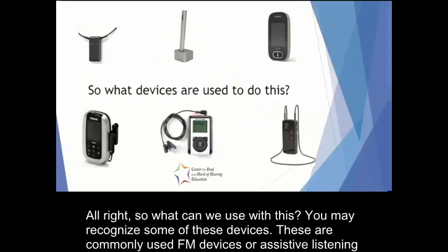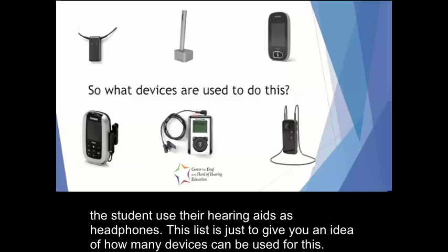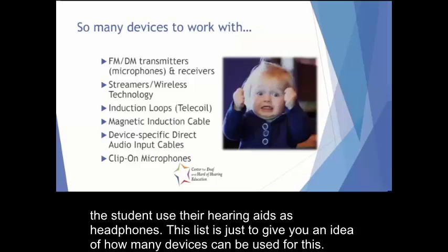You may recognize some of these devices. These are commonly used FM devices or assistive listening technology. As you can see, we have FM receivers and transmitters, streaming technology, induction loop technology. All of these can be used to help the student use their hearing aids as headphones. This list is just to give you an idea of how many devices can be used for this.